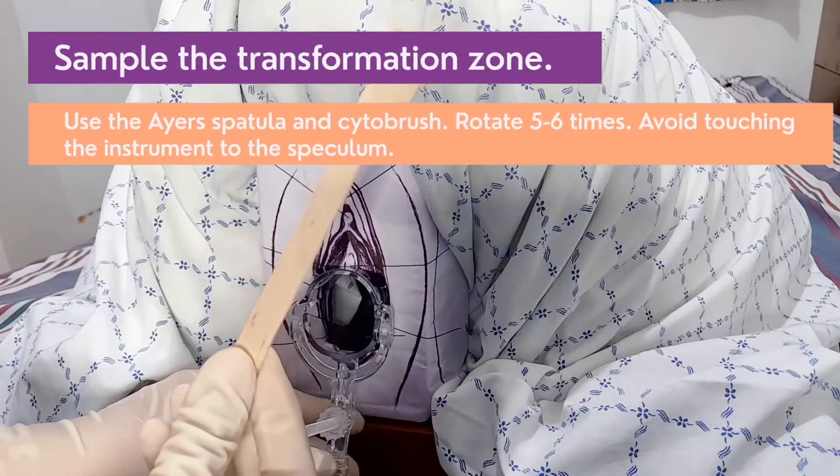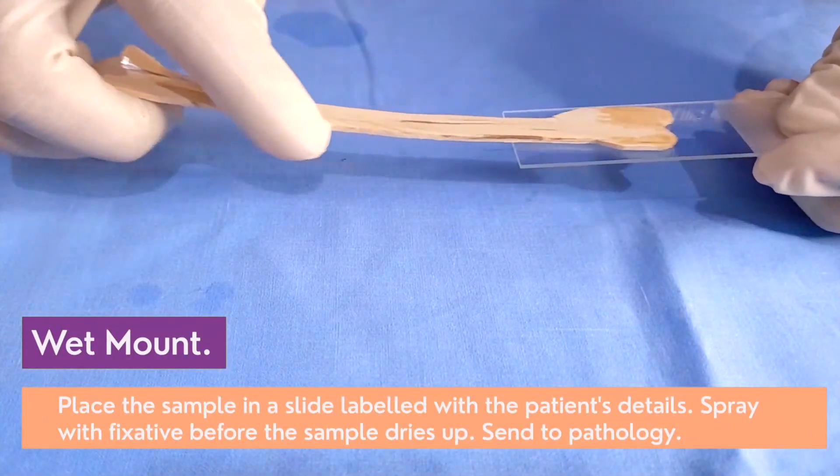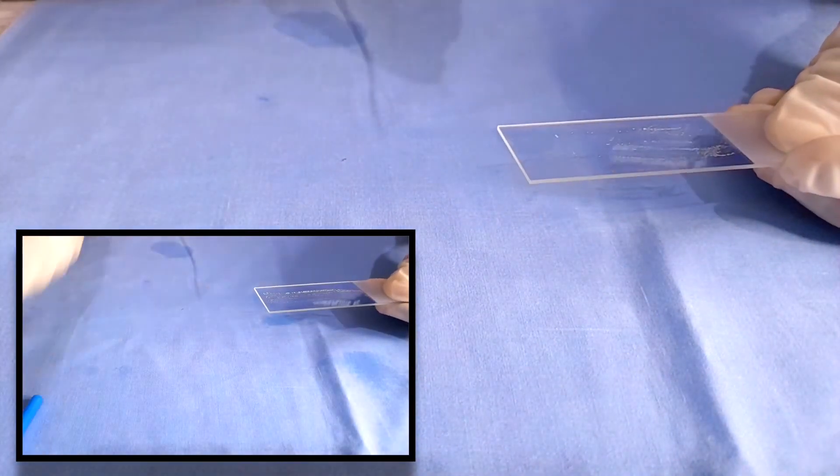Sample the transformation zone using Ayer's spatula and Cytobrush. Rotate the instrument five to six times. Avoid touching your instrument to the speculum. Place the sample on a slide labeled with the patient's details. Spray with fixative before the sample dries up.